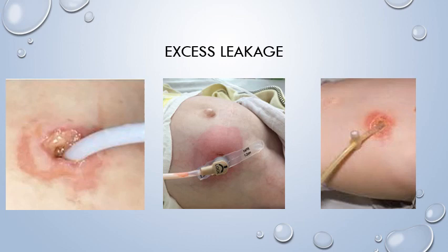Apply a short-term dressing to absorb any excess leakage. Clean the area with mild soap and water. Do not allow wet clothes or wet dressings to remain in contact with the skin, as the stomach acid may cause chemical burns to the skin. Change the dressing and clean the area as frequently as needed. If the stoma is enlarged, the physician may replace the tube to improve stability. Bleeding, redness, irritation around or from the stoma must be reported to the delegating nurse.